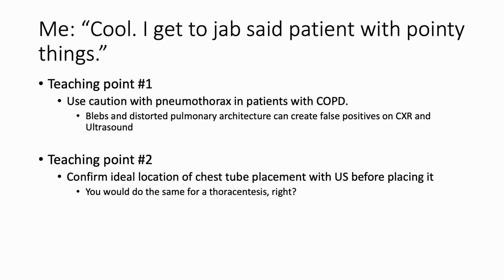I mean, you would essentially do the same thing if you were going to do a thoracentesis, right? You would get an ultrasound out and usually mark the spot that has a nice pocket of fluid. So this is really no different.